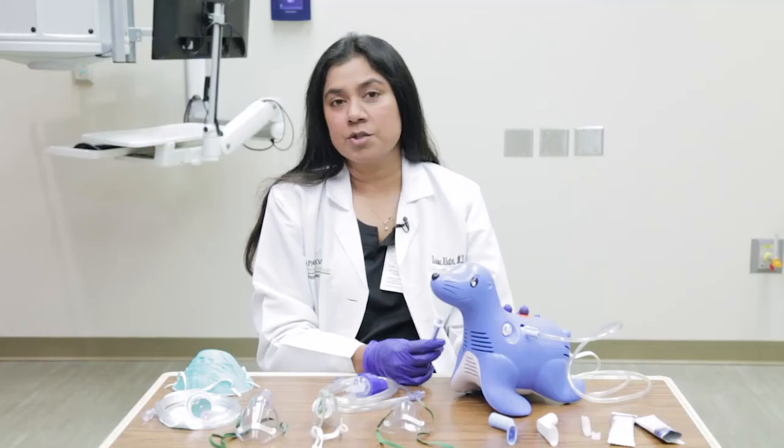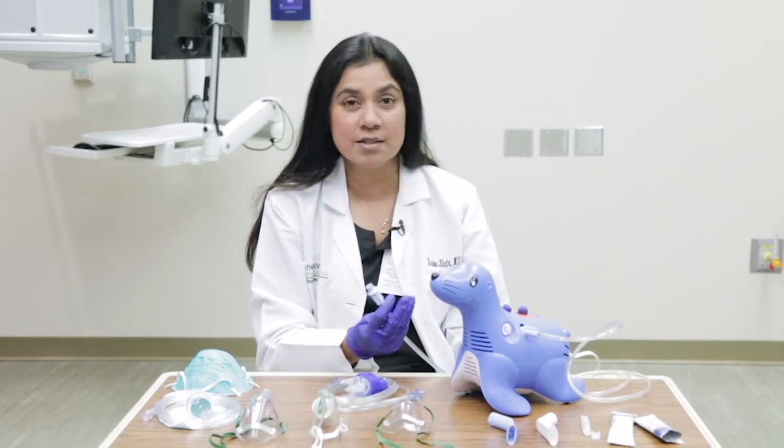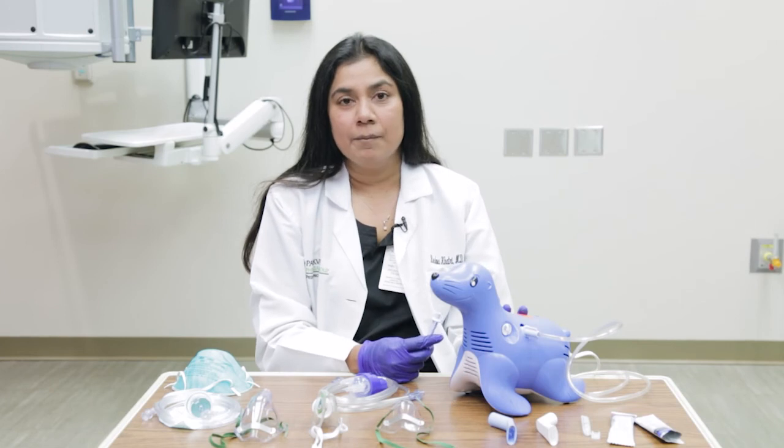Every setup is different. Machines come in different shapes and sizes. Make sure you check with your physician to know how to use the machine and what kind of masks to get for your child, and always touch base with them if you have any questions.